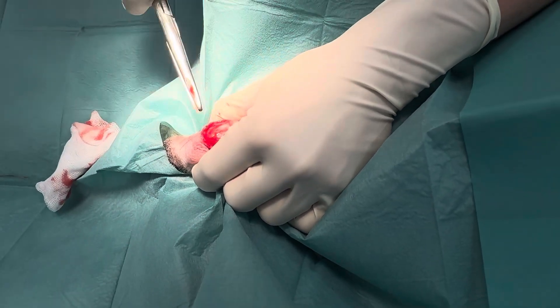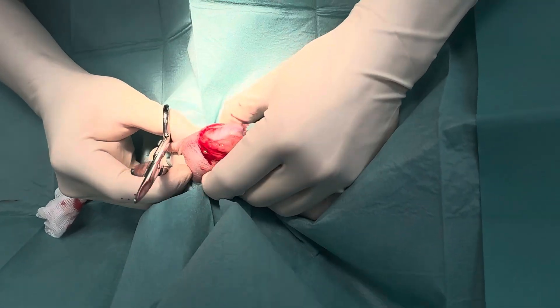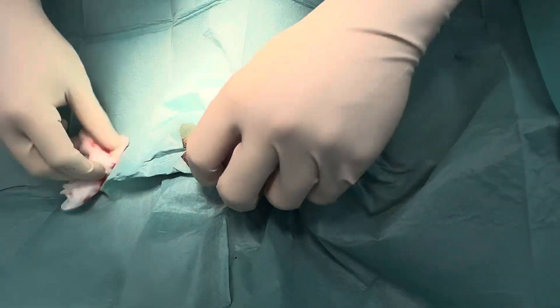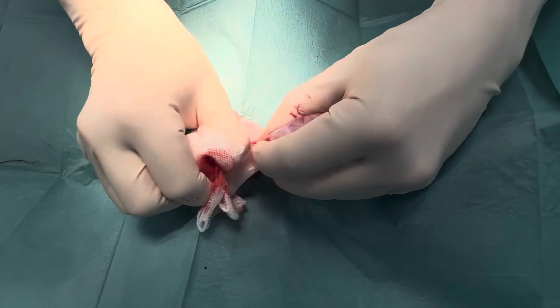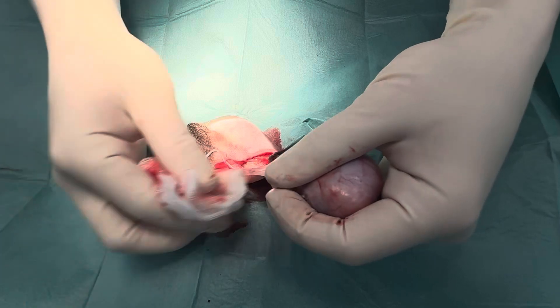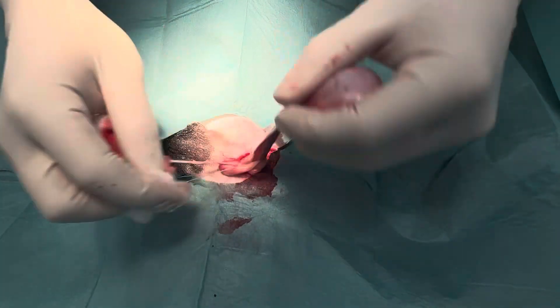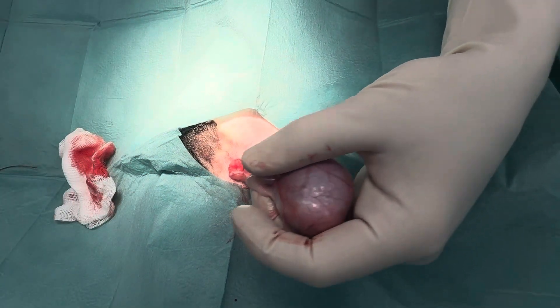One blunt dissection. You don't really want to use the scalpel blade in this area if you can avoid it. You're going to squeeze just like that and it's going to pop out. Same thing again — grab the fatty ligaments and gently pull them away, avoiding any major blood vessels. Get a good visualisation, check there's no excessive bleeding, and then we're just going to clamp.